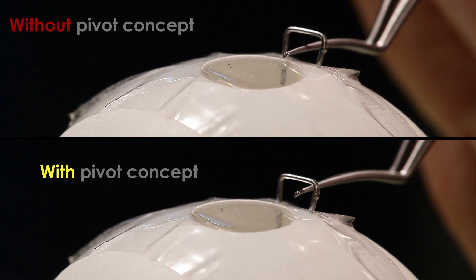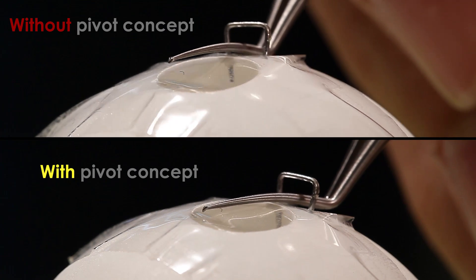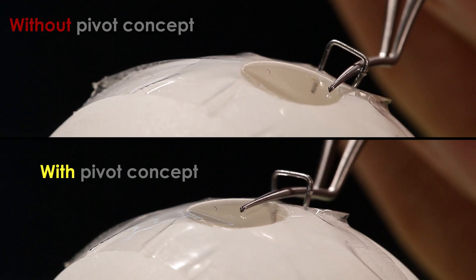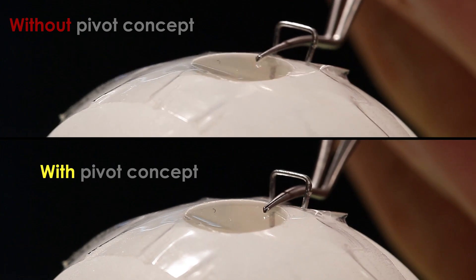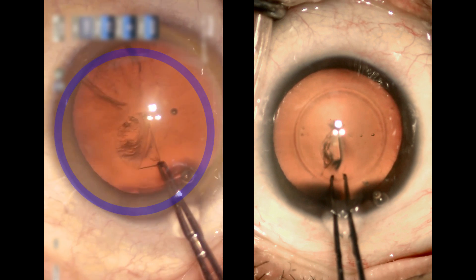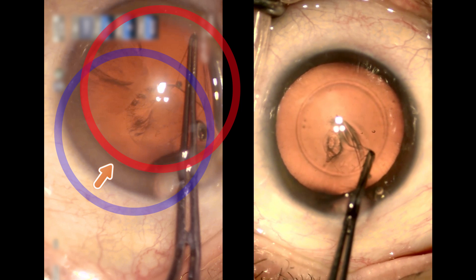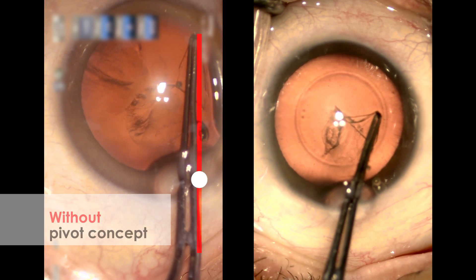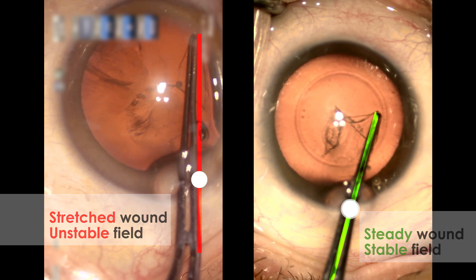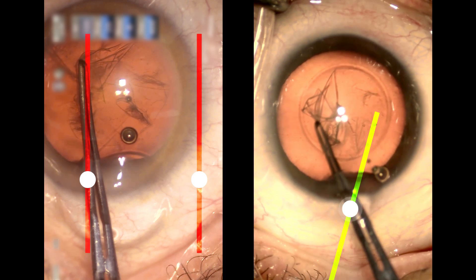You can obviously see the difference between with and without the pivot concept. Without the pivot concept, any forceful pushing of the forceps within the eye by beginning surgeons would cause the eye to move away from primary gaze. With the pivot concept, we can keep the eye in the primary position while performing CCC. Compared to a young surgeon, an expert can manipulate a precise CCC without pulling or distorting the patient's eyeball.